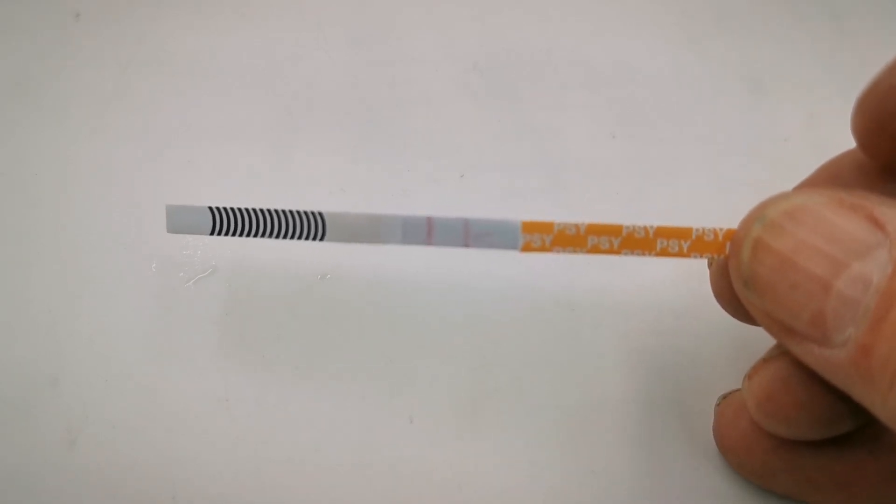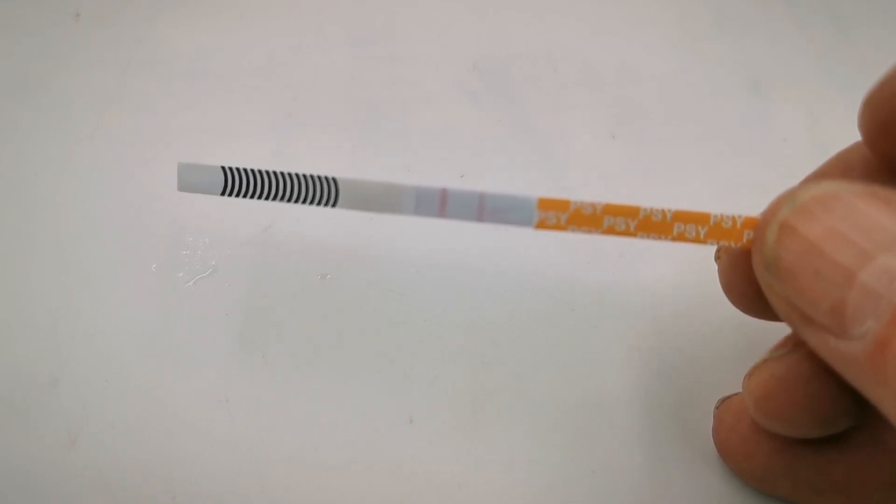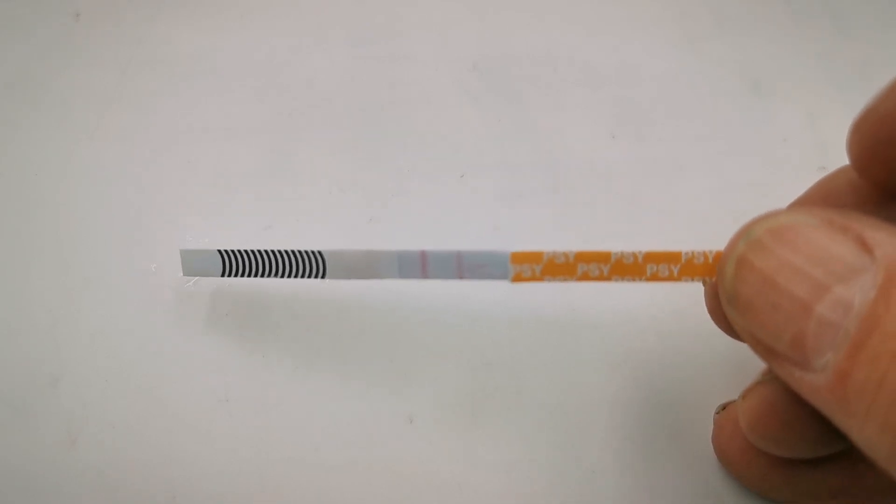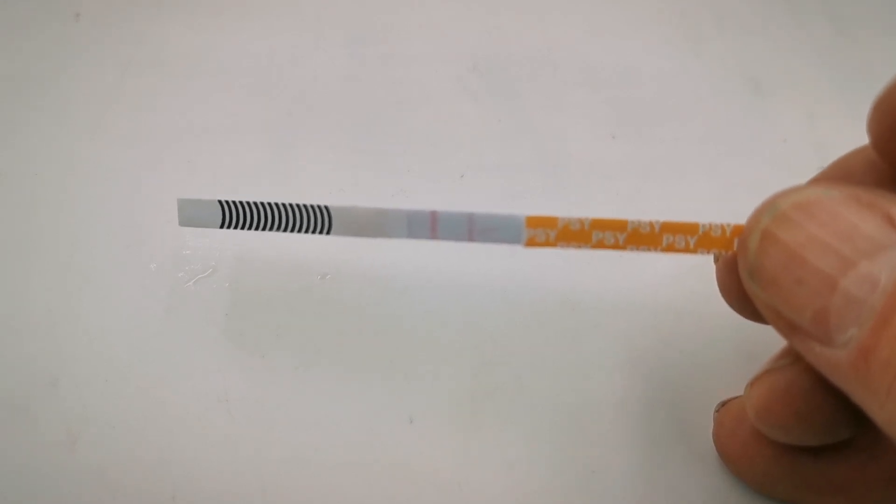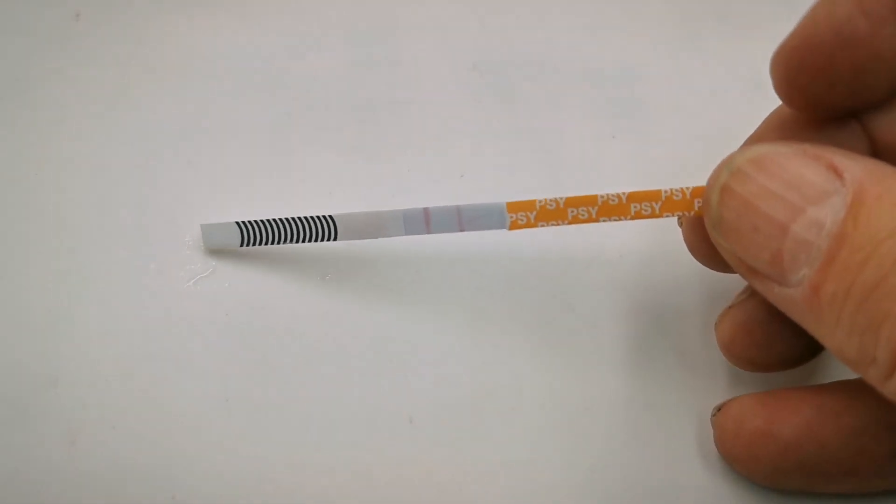So that's how to screen urine for psilocybin magic mushrooms at the 500 nanogram cutoff that these tests detect down to and that is a tiny amount so it will pick up those residues for the period of time quoted in the test listing.